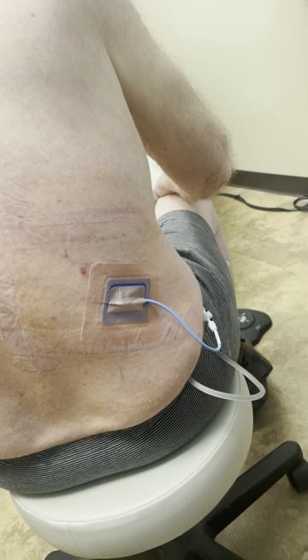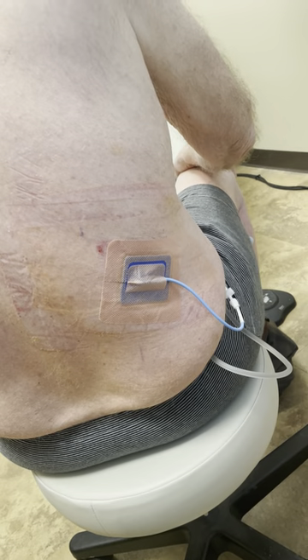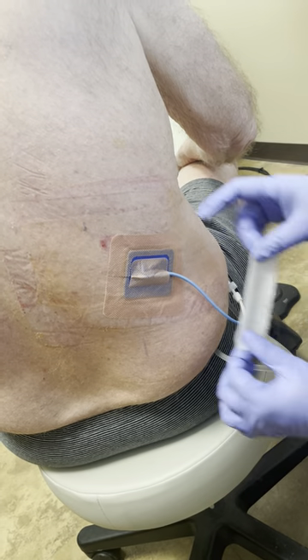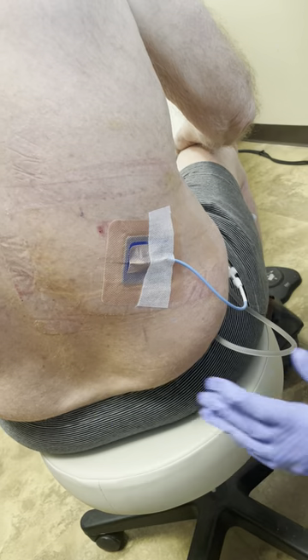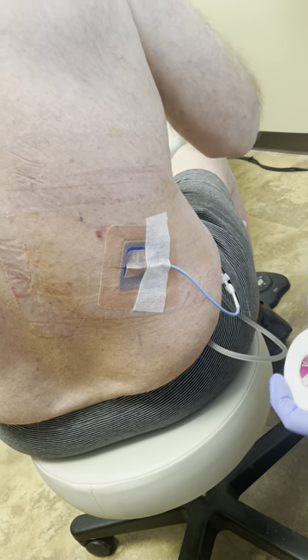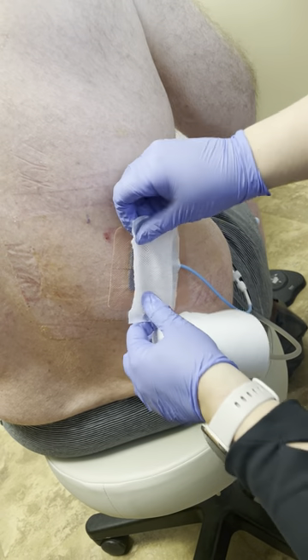Now, because you guys have it spread out like every week, I like to use this extra tape, just because this is a little flimsy tab. So I like to put just another piece of this here, and then right here.